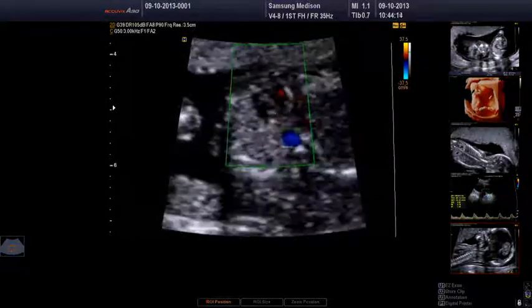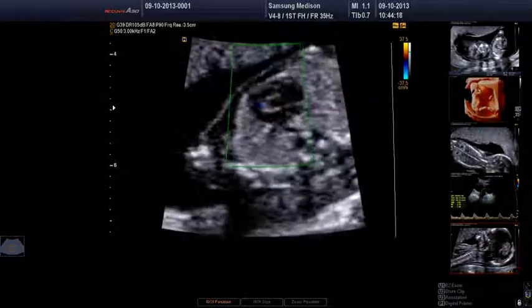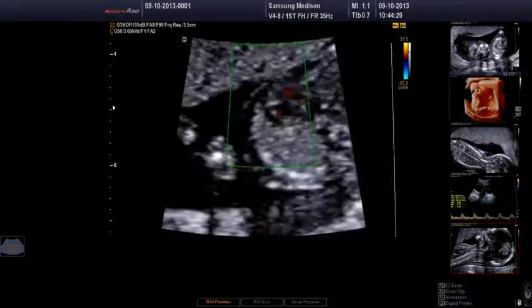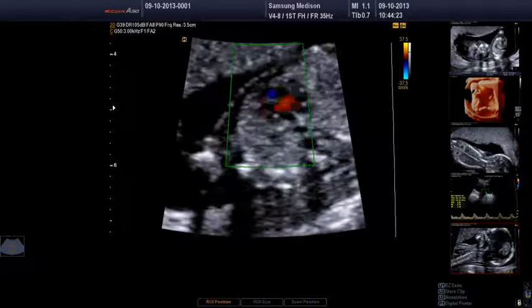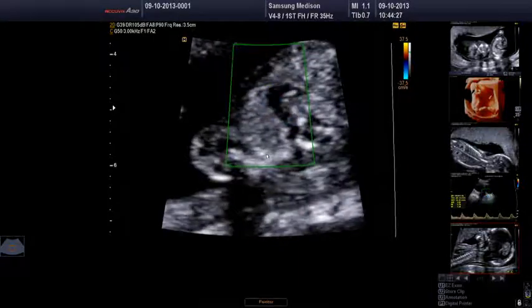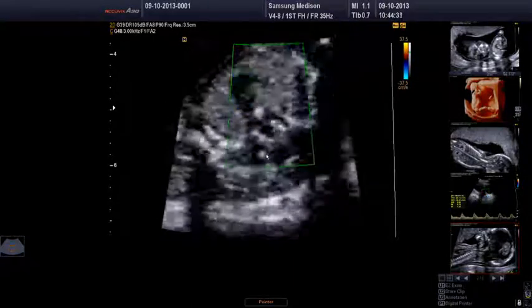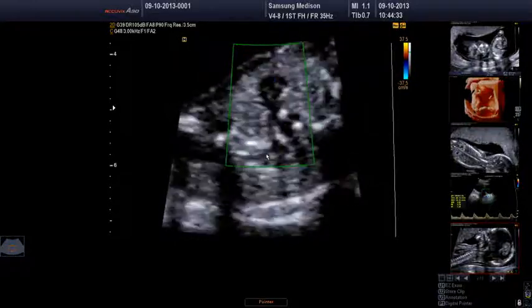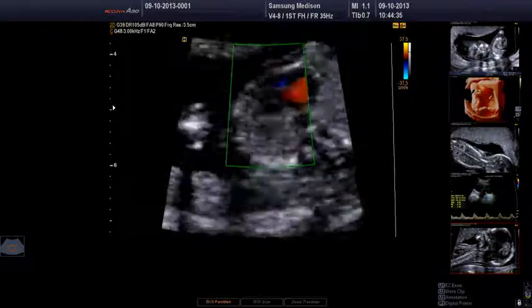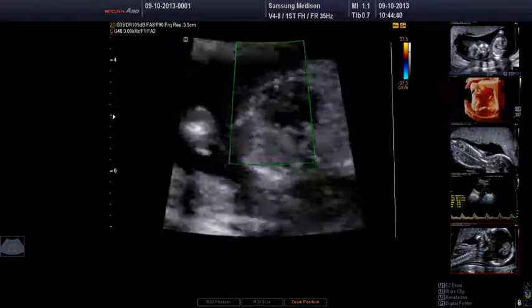So just coming down to the level of the ventricles to start with, we can show that we've got biventricular flow, and then we can look at the left ventricular outflow tract that you can see going up there in red, and then if I keep on coming up, we get the pulmonary trunk coming down. And again, if I just flick the probe around a little bit, we can see those vessels coming in together there. That's a better example.